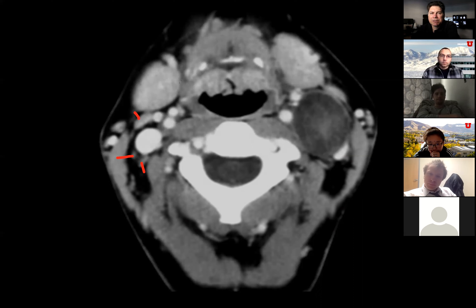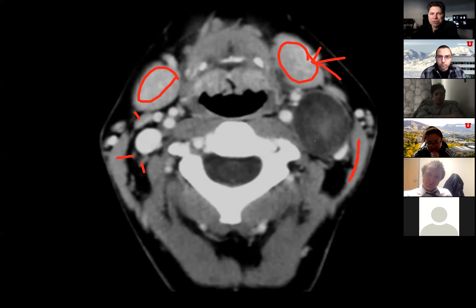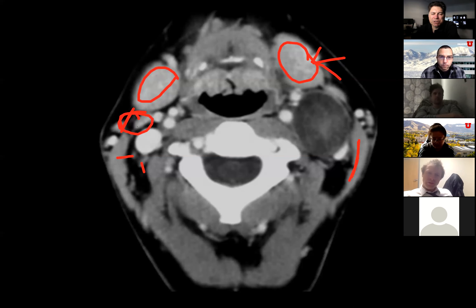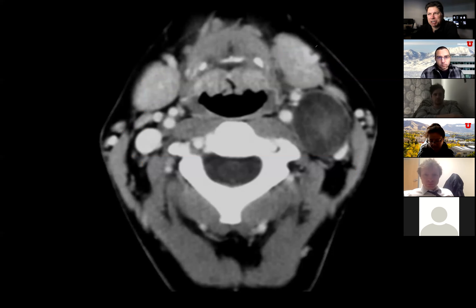Could this be a necrotic lymph node? We think about lymph nodes as associated with the carotid sheath or space — we do see lymph nodes around that area. The SCM is way out laterally. There's this space between the platysma, the submandibular gland, and the SCM that we think of as the parotid tail. But this is between the jug and the carotid — it's splaying those vessels.